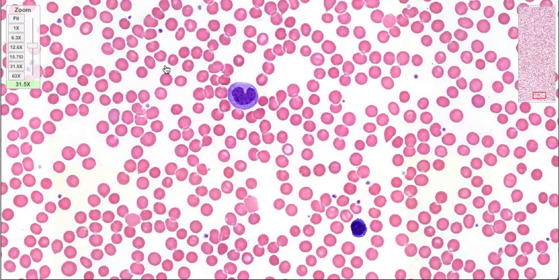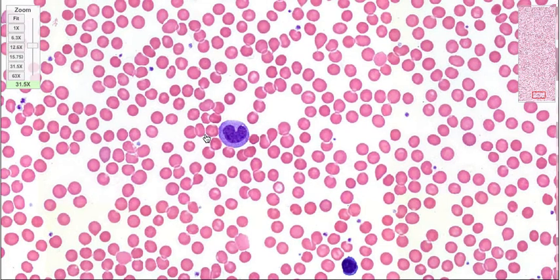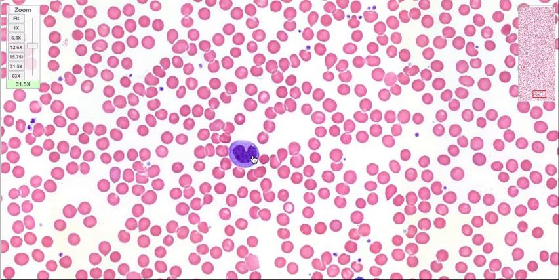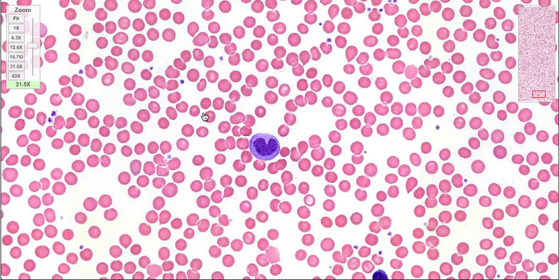Monocytes are about 10% of the white blood cells. Again, a single big nucleus. These guys form part of the innate immune system, and are one of the largest, if not the largest, white blood cell within the blood. And interestingly, when they move out from the blood and respond to an infection or inflammation, they can differentiate into a macrophage.